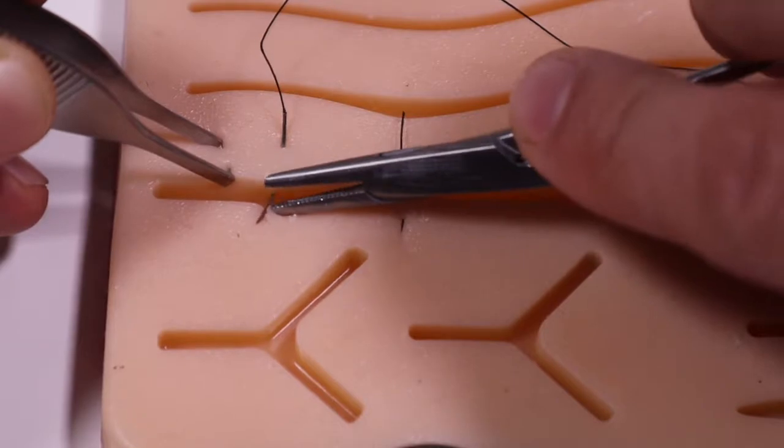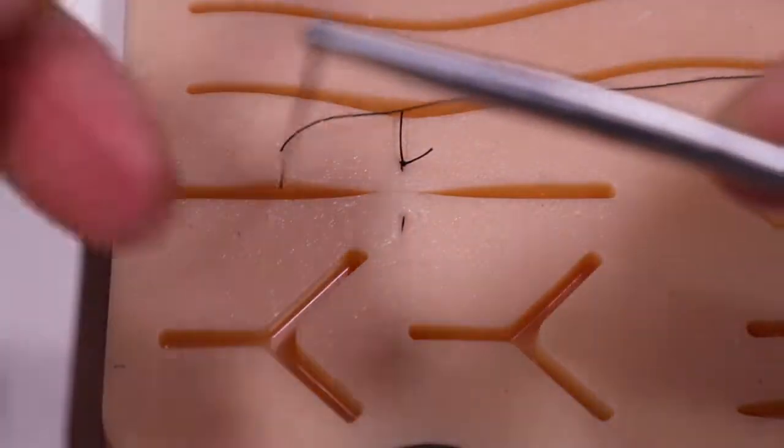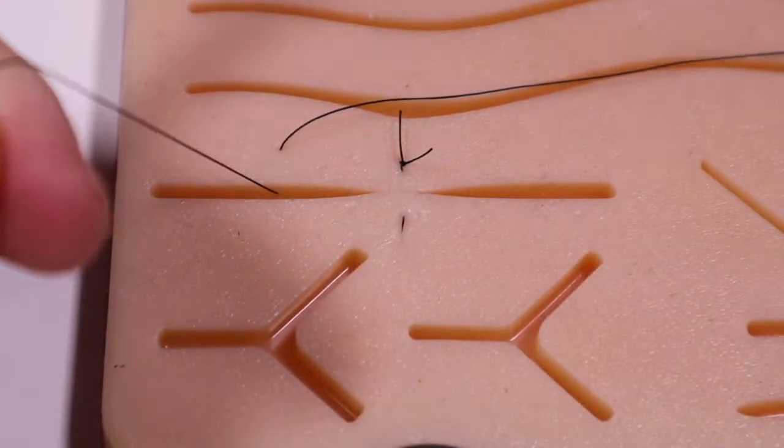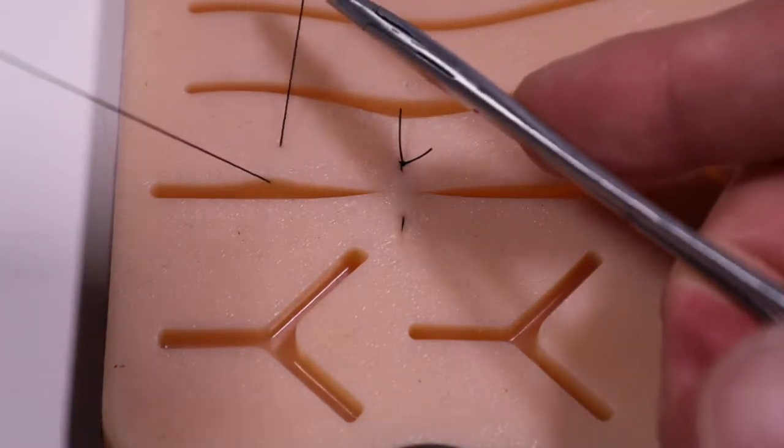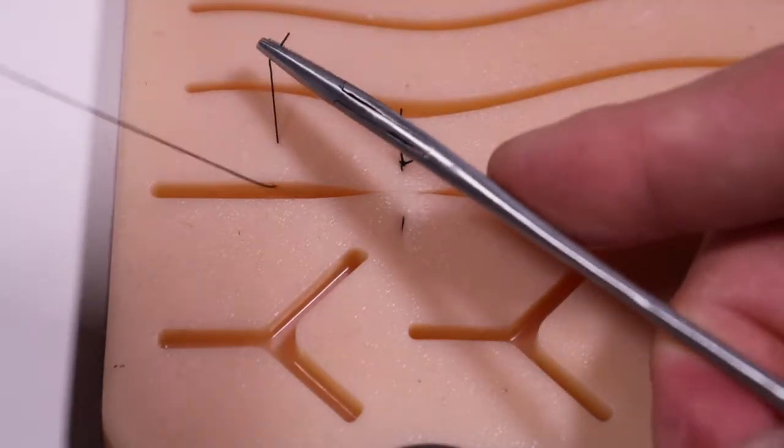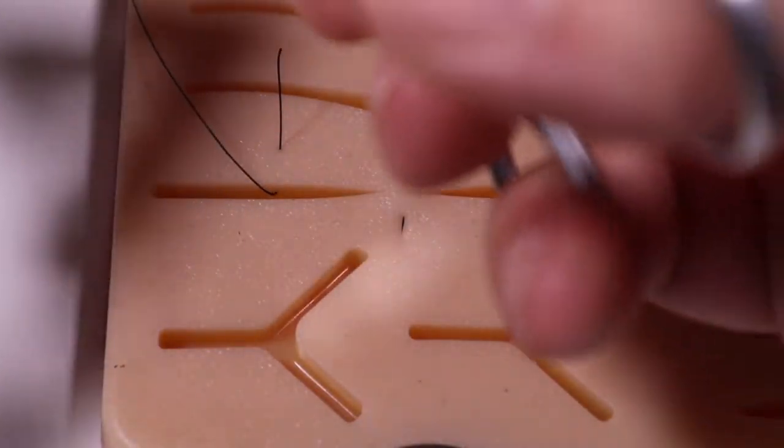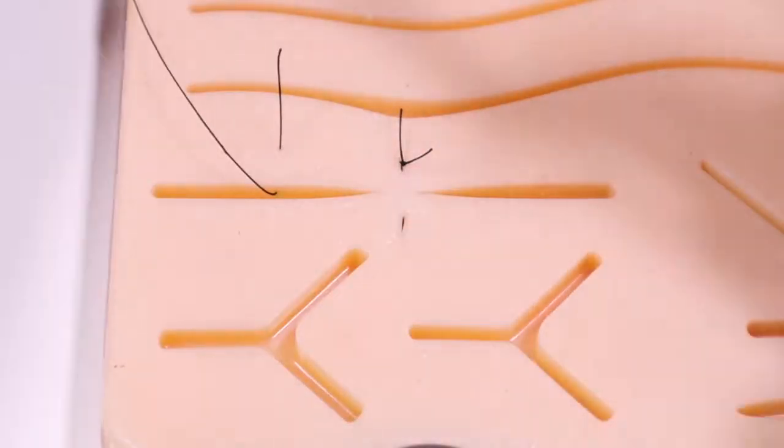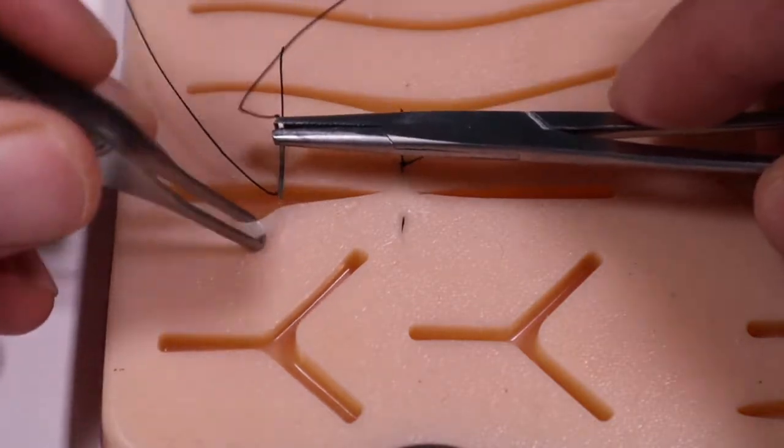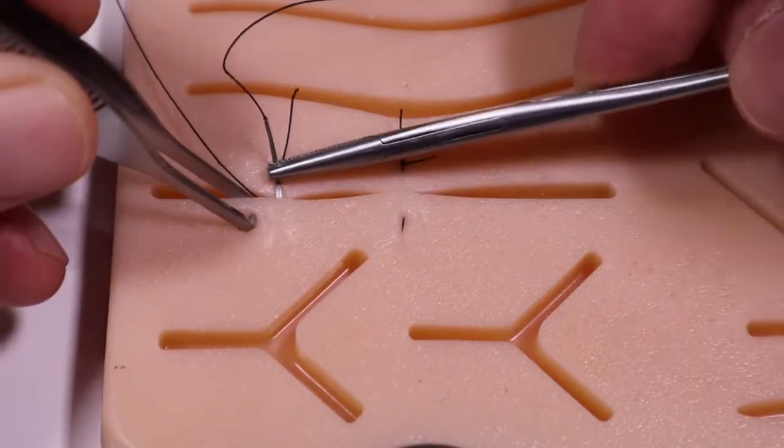Just a reminder of general suturing technique: the needle enters the skin at a 90-degree angle, and then you rotate your wrist through. Enter at the same depth that we exited.